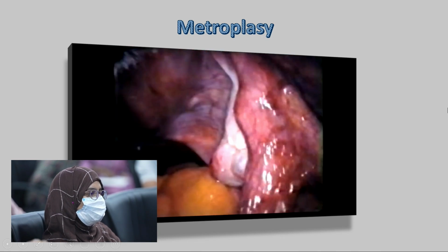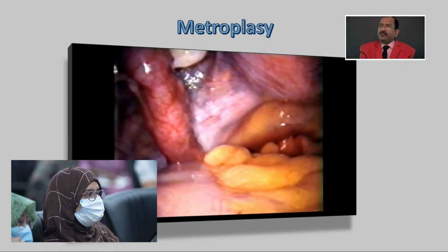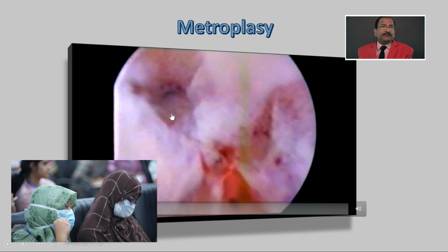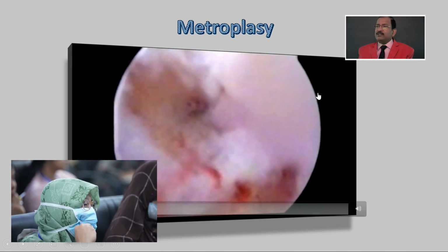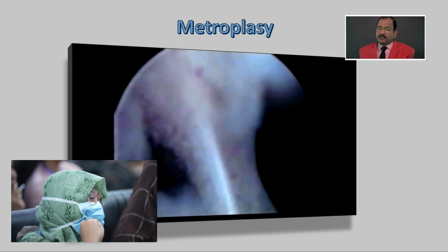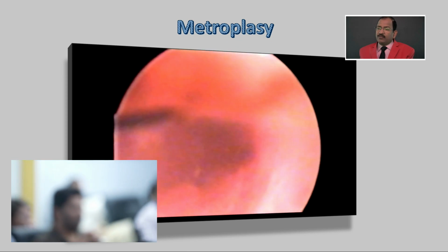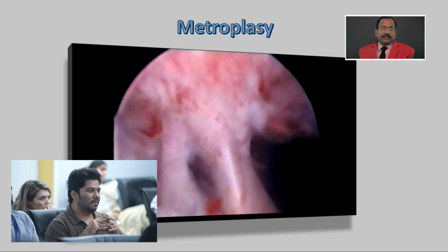This patient's ovary is good, tube is good, everything is good. The only problem is with the septa. So here this is hysteroscopy. This is the right ostia, and here is the septa, then you have the left ostia. So you will check the ostia on either side, and after that you will take it out and you will take the Collins knife.